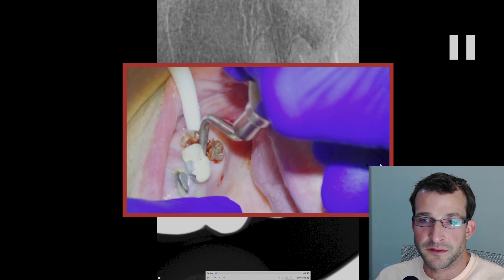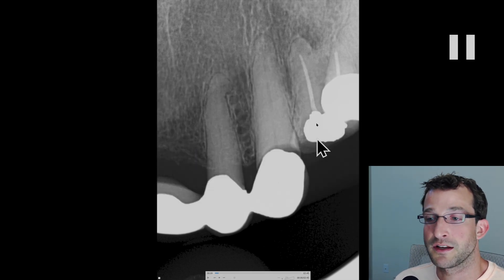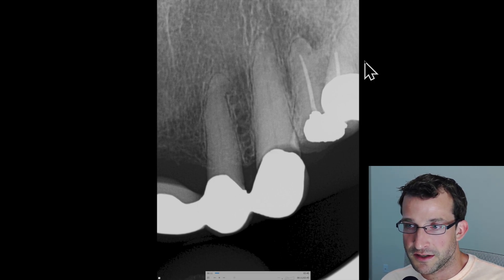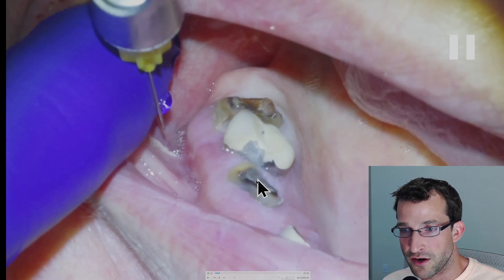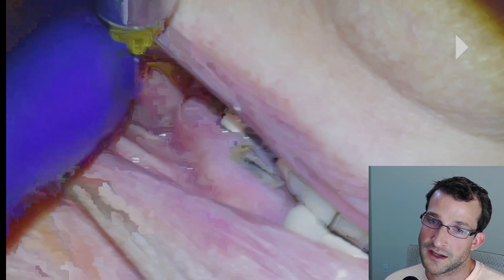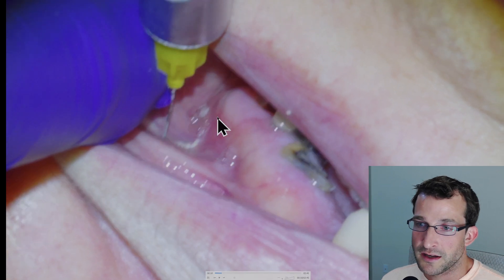Hey guys, Dr. Dobson. We're going to be doing surgical extraction of a #26 in this video. This is the wrong x-ray, actually — old x-ray. This #23 ended up abscessing so we sectioned the bridge, but clinically the situation basically looks like this: the #24 has a stable endo, the #25 has a PFM with some fractured porcelain. The patient didn't want anything done with those. The #26 fractured off at the gum line, did not have a root canal, so it's beginning to cause symptoms and the patient wanted it out.